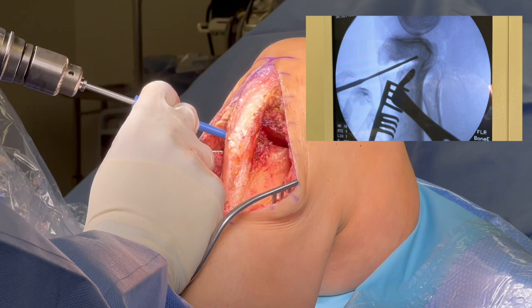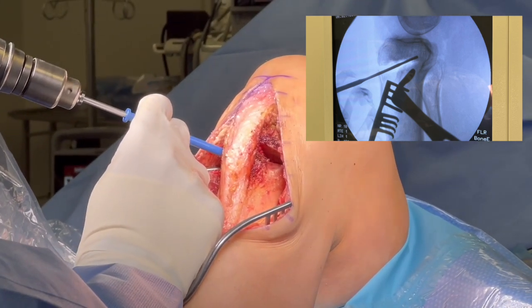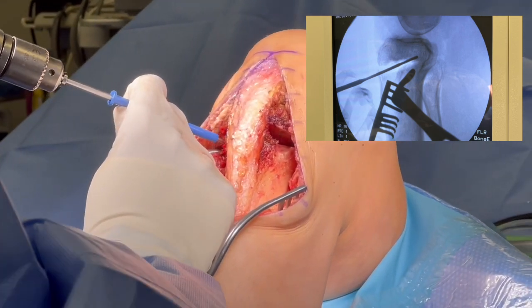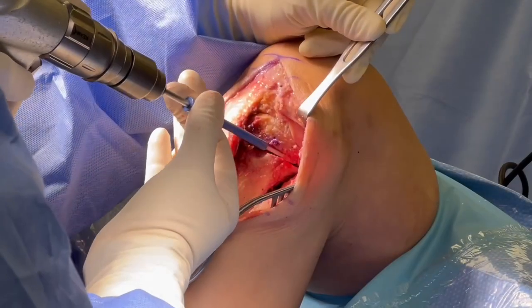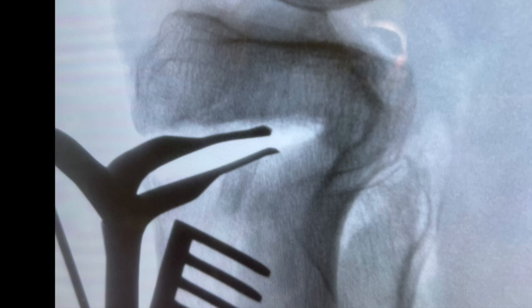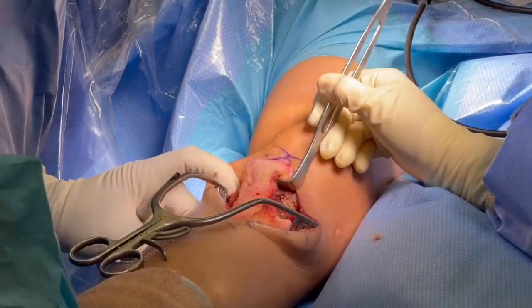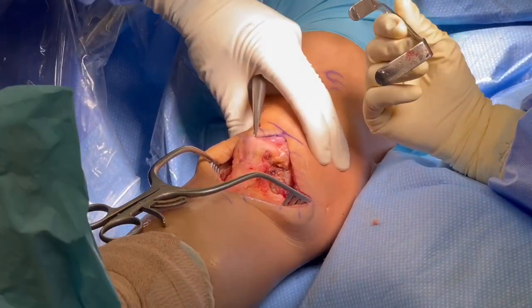We're going to finish off a little bit more with the TPS saw blade, making sure that we can collapse. This is actually the guide for a trochleoplasty, and you can use this to take out the back part of the closing wedge. You can watch on fluoroscopy to make sure you don't penetrate it, and this allows you to take out that cancellous bone. We have a really nice gap there and a good closure. We pre-measured for about a 9mm closure to correct about 8 degrees.